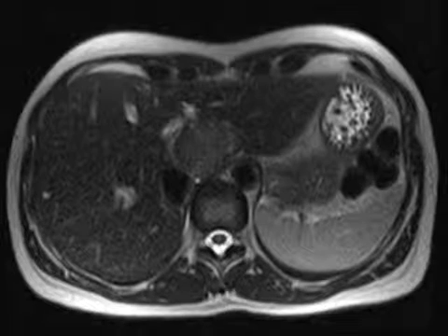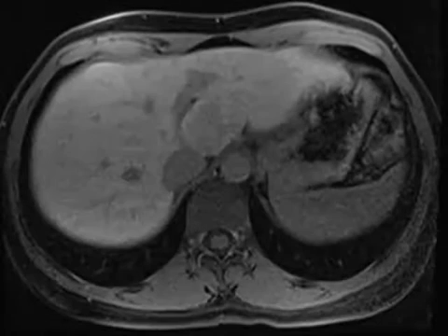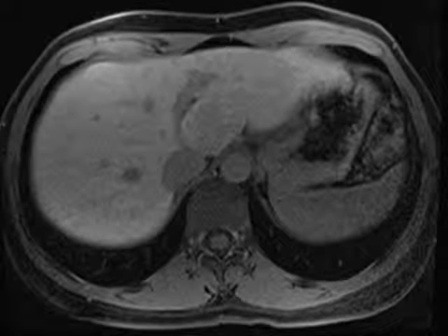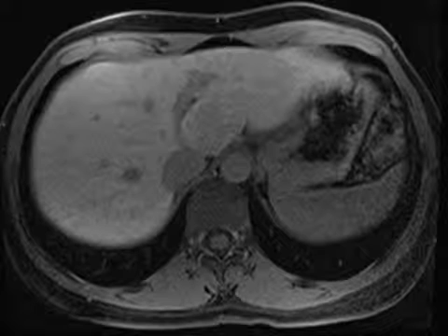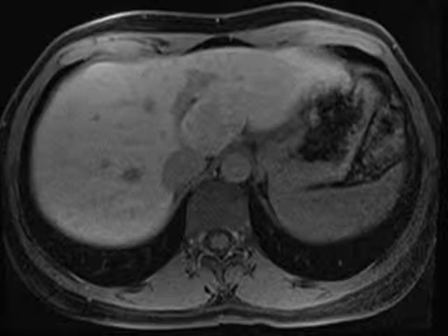Here's another nice example of an entity that can be diagnosed very readily on MR, provided that you use the right protocol options. Without showing any CT images, this was a mass that was considered indeterminate on a CT scan. It was hypervascular, looked pretty homogeneous. We thought maybe it was an FNH, but we weren't entirely comfortable making that diagnosis with confidence.